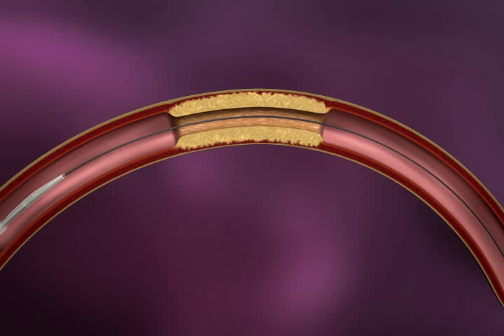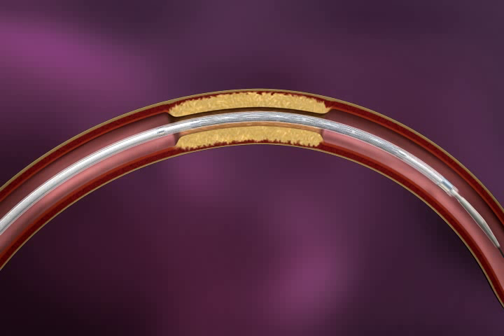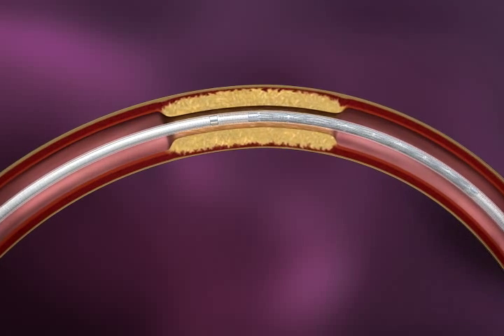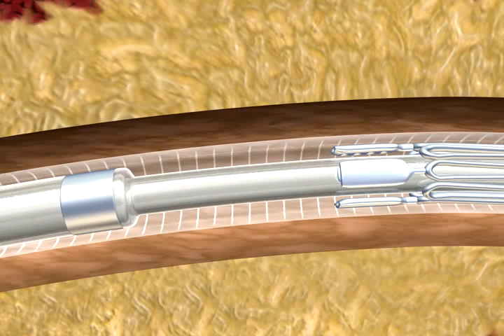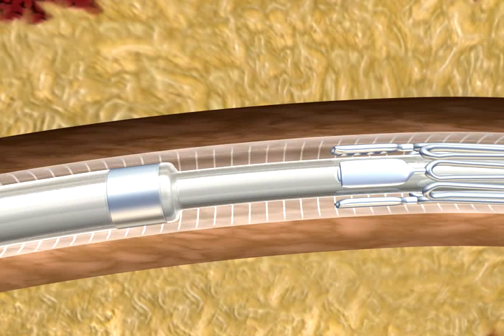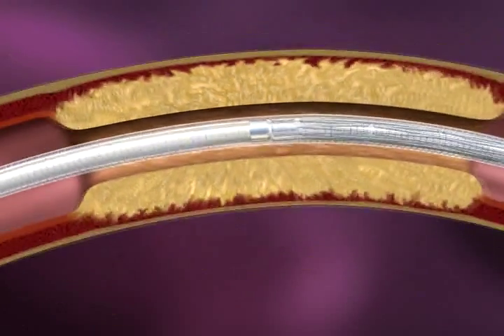Advance the Wingspan Stent System over the exchange length guide wire. Continue to advance the delivery system over the guide wire until the stent is slightly distal to the target lesion. Observe the proximal and distal marker bands indicating stent position. Advance the inner body of the delivery system until the proximal marker band bumper is just proximal to the stent. This prepares the stent for deployment.